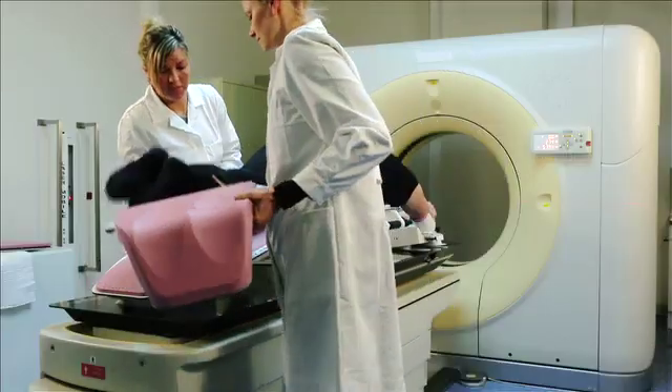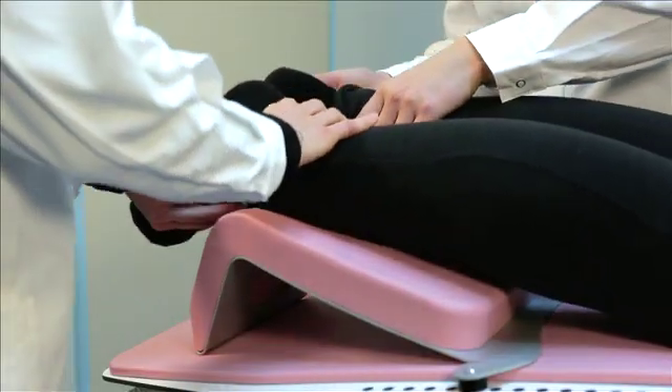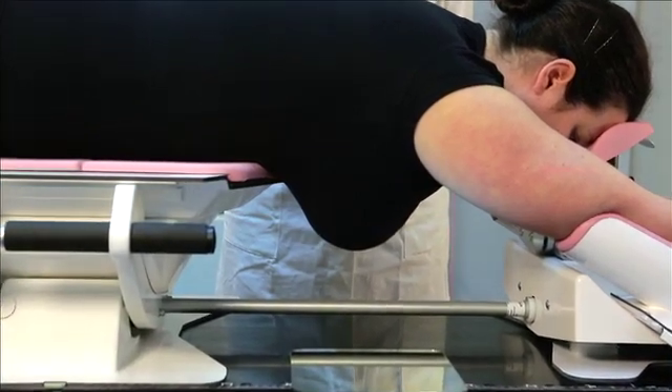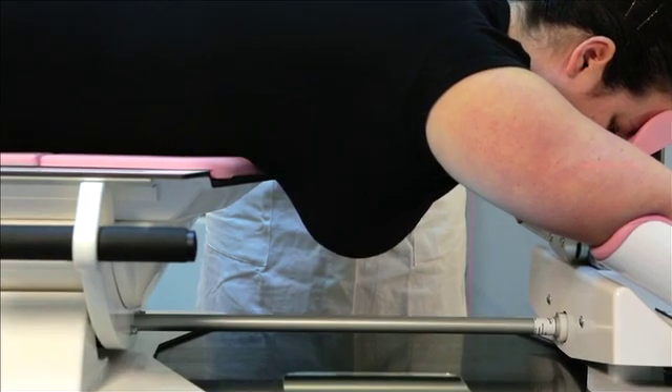The foot support should support the ankles and lower legs of the patient. Verify that the ipsilateral breast drops down in the middle of the cutout and that it doesn't touch the chin support or the border of the cutout.